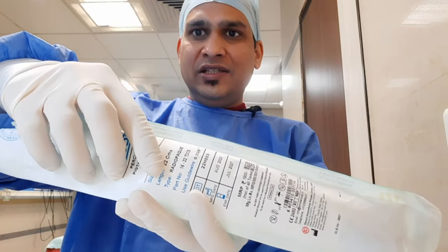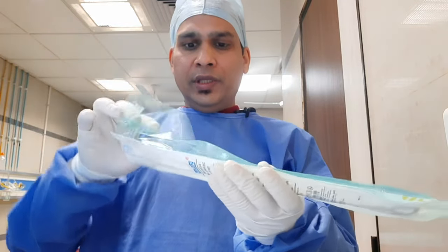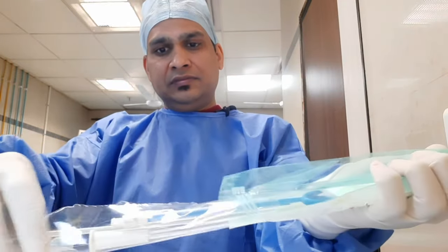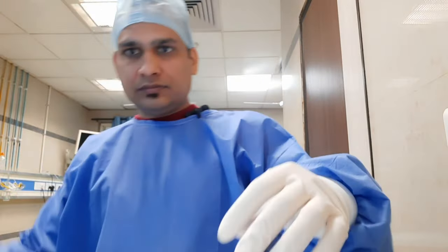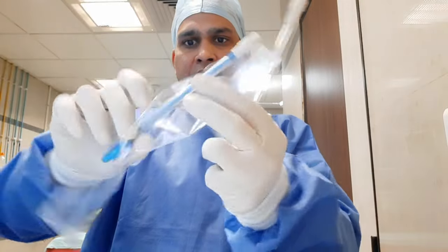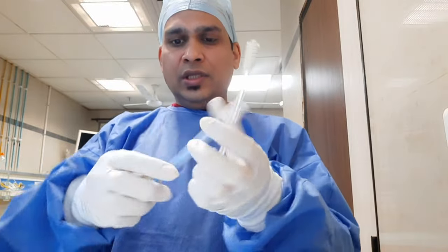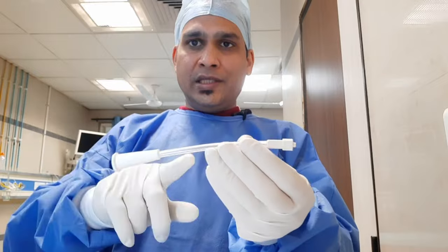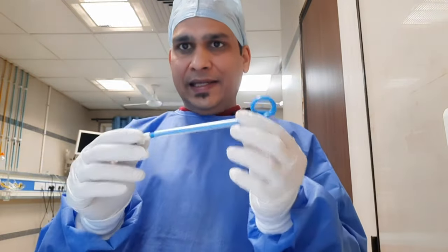Good morning friends, today we will see a live procedure of pigtail catheterization in a case of pleural effusion. This is our pigtail catheter — you can see this is 16 French. We will open it and see what is inside this set. There are three things: one is the trocar, another is the pigtail catheter, and another is the connector which connects the pigtail catheter to the ICD bag.